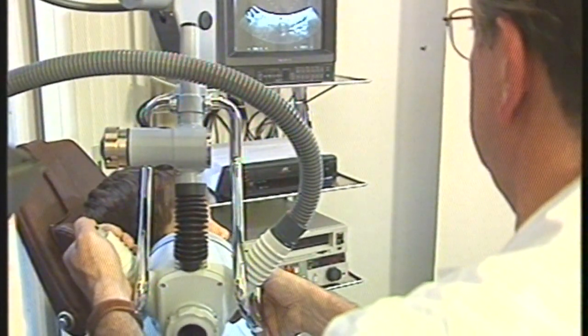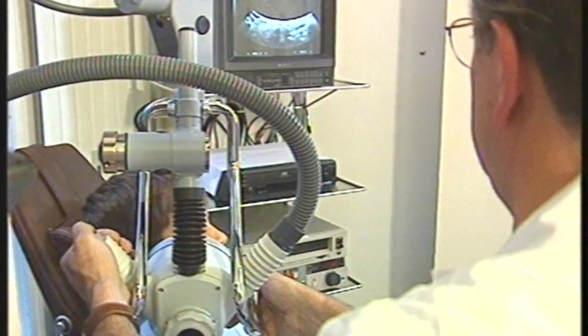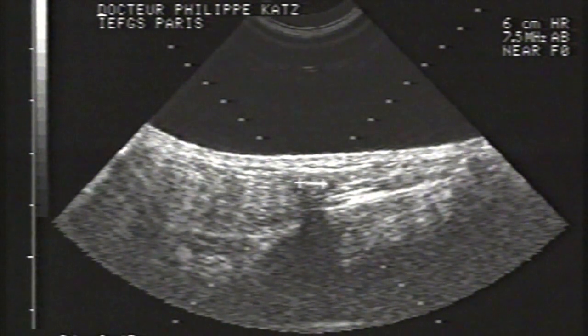The patient sits in an upright position. The procedure is extremely simple. One starts with perfect positioning, using a manual switch on the tube facing the stone. Stone size has no importance, but its location by ultrasonic control is essential.